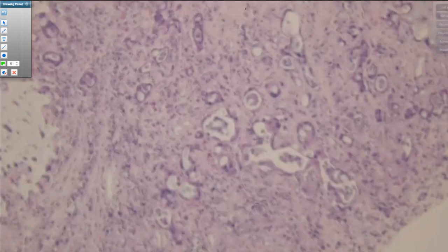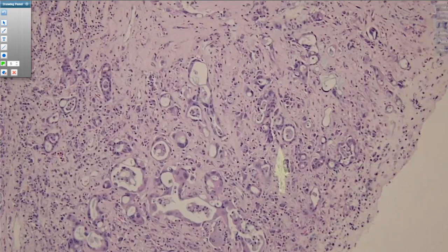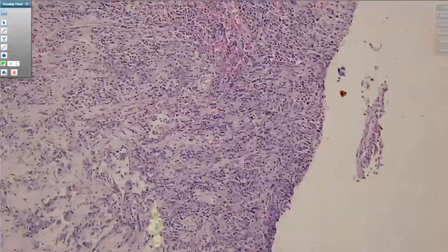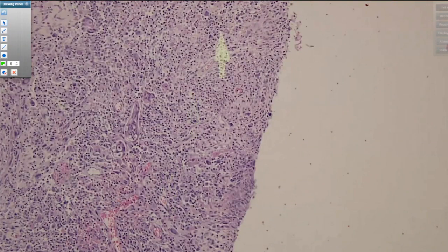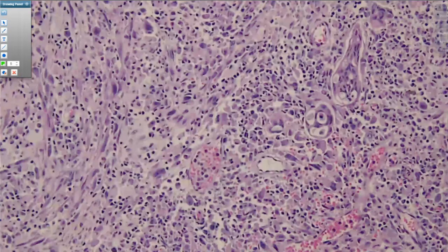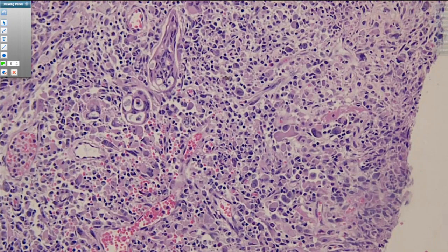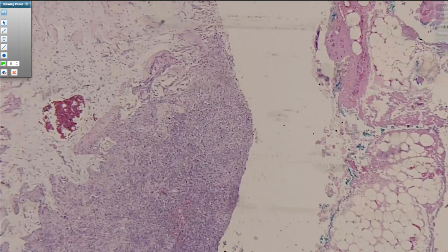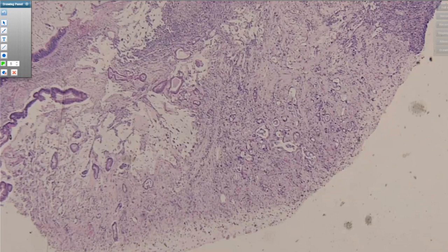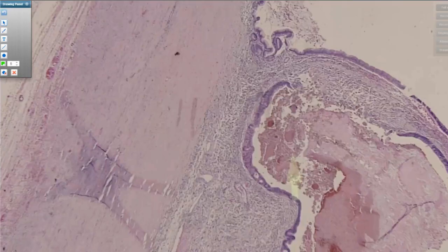there was a more conventional looking invasive adenocarcinoma that again blends into this undifferentiated area with not as many good giant cells in this particular slide, but some guys that were reminiscent, that might be those osteoclast-like giant cells. So this was an invasive adenocarcinoma arising in an MCN that had a component of undifferentiated carcinoma with osteoclast-like giant cells. Now, what's particularly unusual about this case is that it really didn't seem to invade beyond that ovarian stroma.